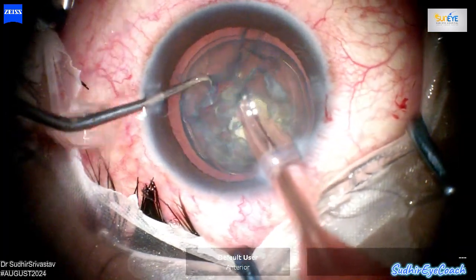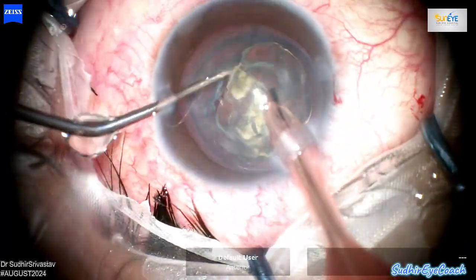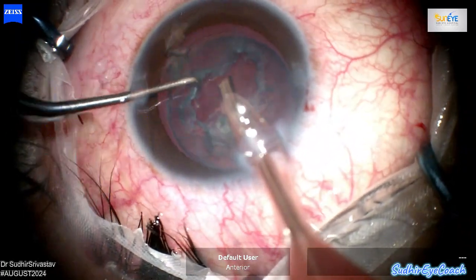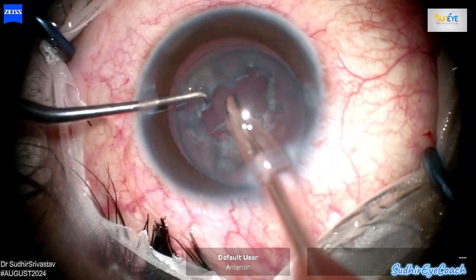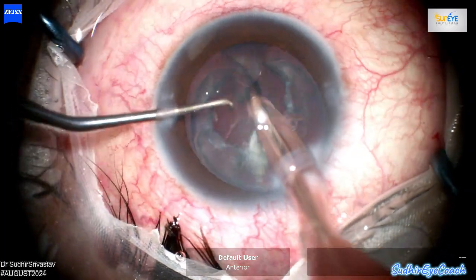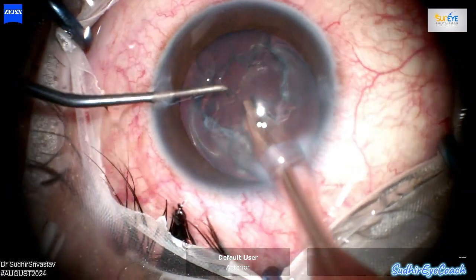Here I started the phaco fragmentation. I reduced the intraocular pressure to around 40 mmHg to minimize stress on the posterior capsule. Lowering the pressure can help prevent further extension of existing defects during manipulation and surgery.